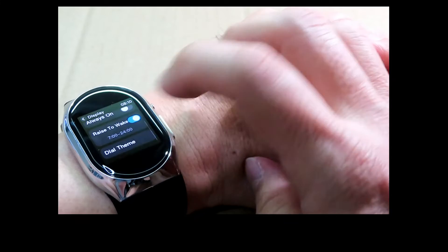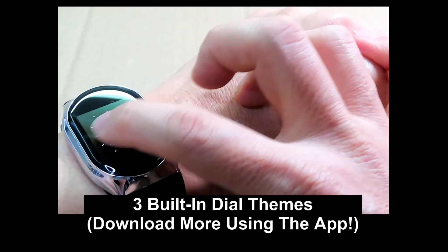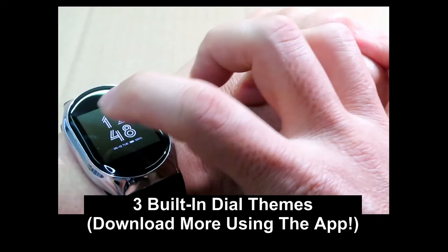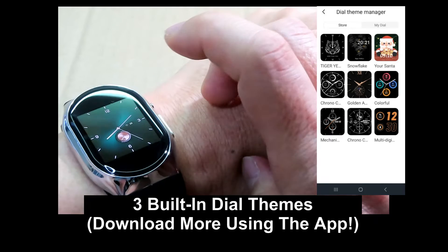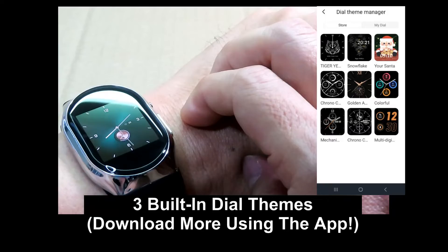For the dial themes, there are actually three built into the watch. However, you can download more dial themes using the app.